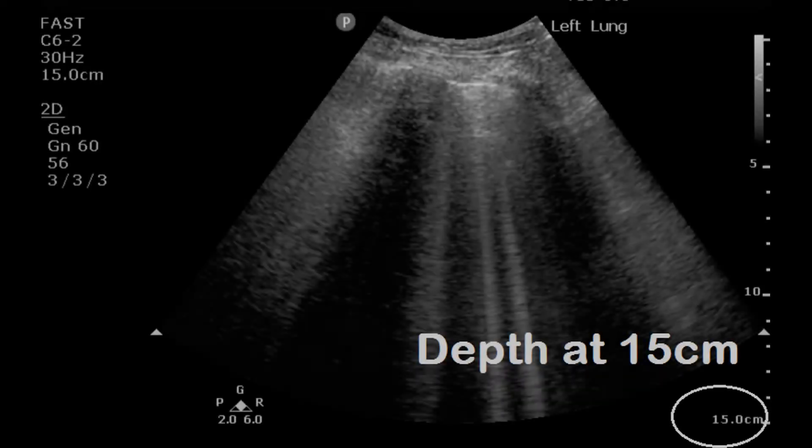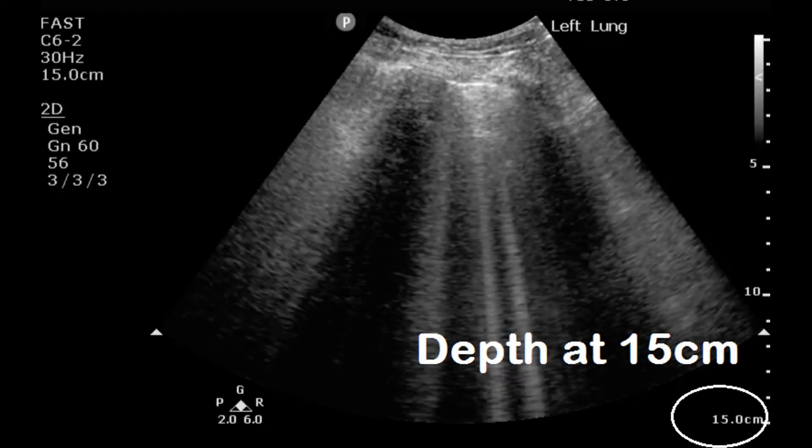Step two: set the depth to greater than 10 centimeters, typically 15 centimeters, so you confirm that the things you think are B lines actually reach the edge of the screen.